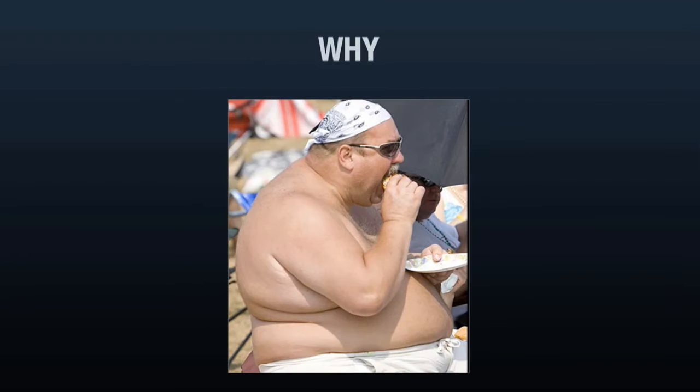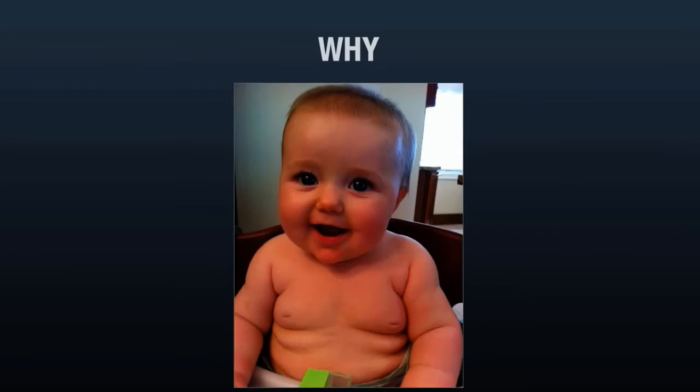Well, not all of our patients look like this. Frequently, our patients look more like this. They have quite a bit of subcutaneous tissue to get through, and it's very difficult to find a vein to cannulate. And not just obese patients. Sometimes IV drug users have very difficult access, or just chronically ill patients, or patients like this. Babies are difficult access in general, and when you have one with quite a bit of tissue like this one, then it can be really challenging.